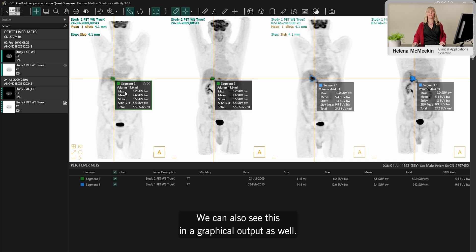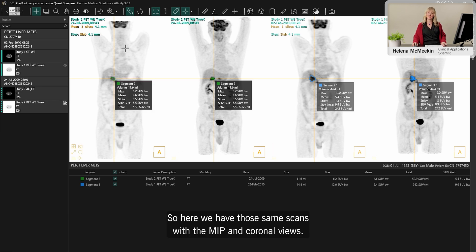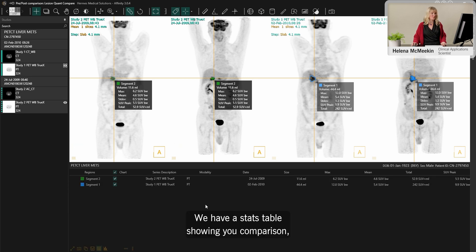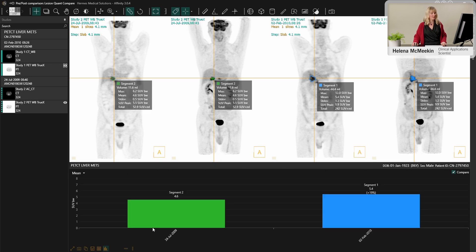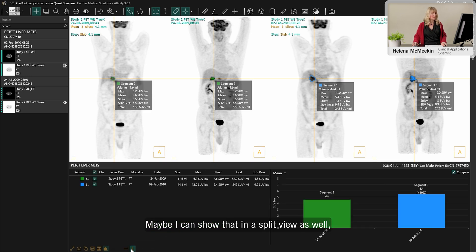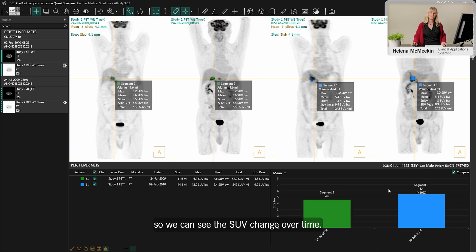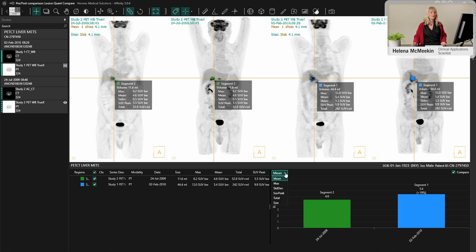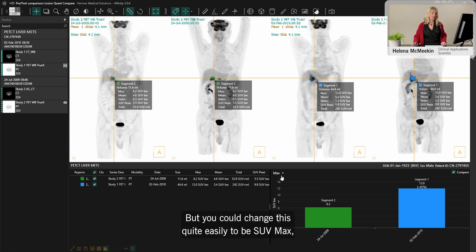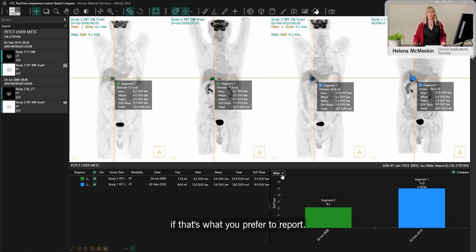We can also see this in a graphical output. Here we have those same scans with the MIP and coronal views, a stats table showing comparison, and we can toggle a column chart to see the SUV change over time — in this case it's a change of plus 19% for SUV mean, but you could easily switch this to SUV max if that's what you prefer to report.